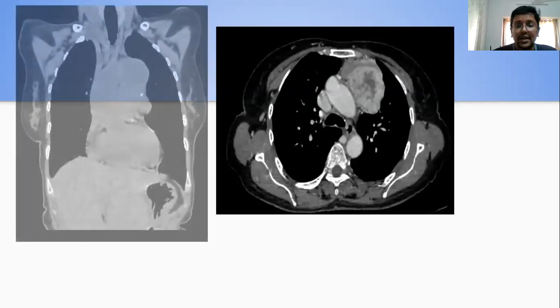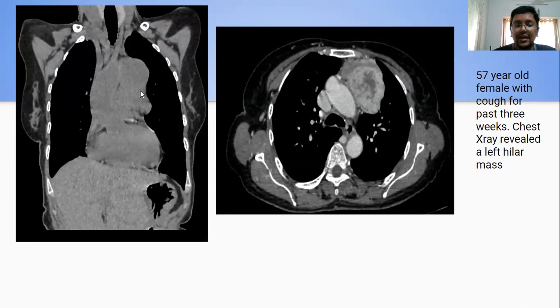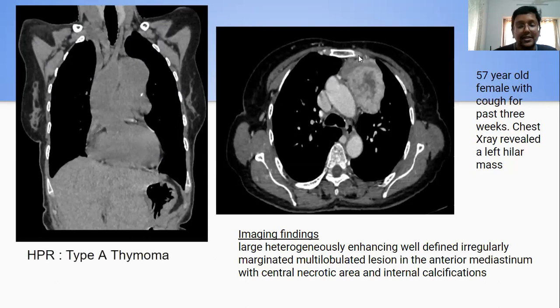My next case was a 57-year-old female who presented with cough for the past three weeks. Chest X-ray revealed a left hilar mass. The plain coronal reformatted image showed a lobulated, well-defined lesion with a tiny speck of calcification involving the anterior mediastinum, more towards the left side, with heterogeneous post-contrast enhancement. Importantly, there was no evidence of vascular invasion or infiltration, and no bony erosions. This also turned out to be a type A thymoma.